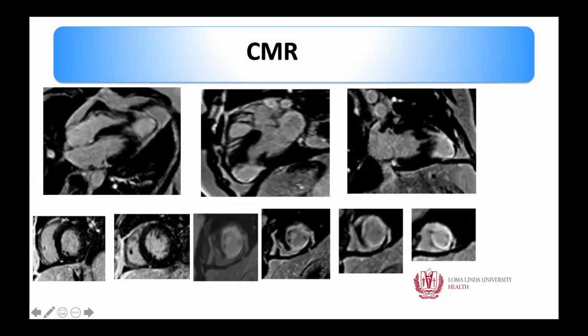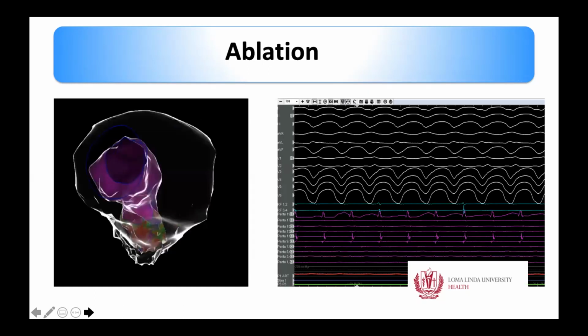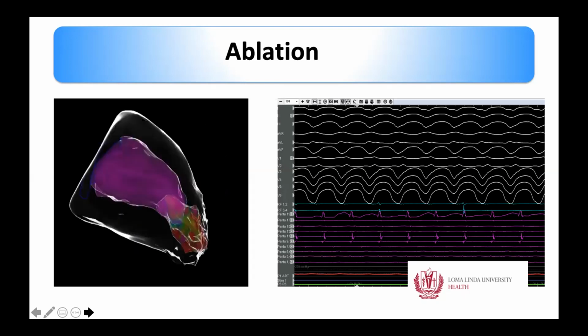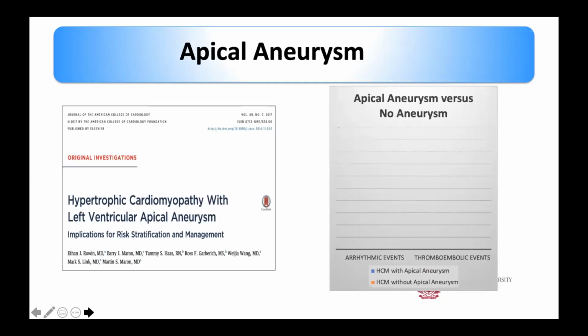And again, it should be normal like this all the way down, but you see that there is an apical infarct. So this patient was sent for ablation, and they were able to ablate this arrhythmia. But I just wanted to show you all, because there are two things that are associated with patients that have mid-ventricular cavity obstruction with apical aneurysm.